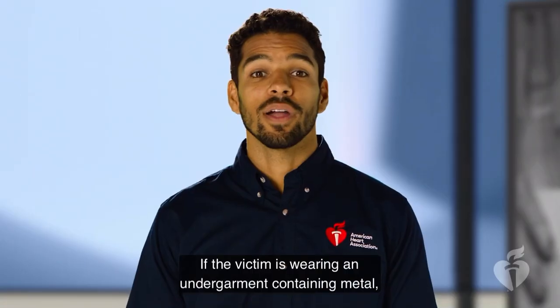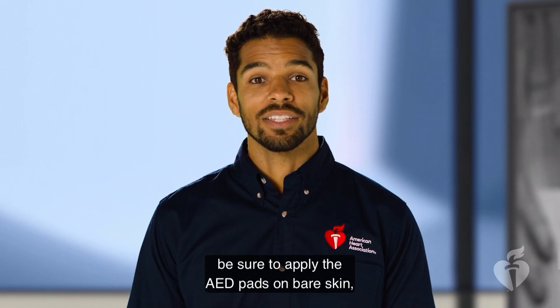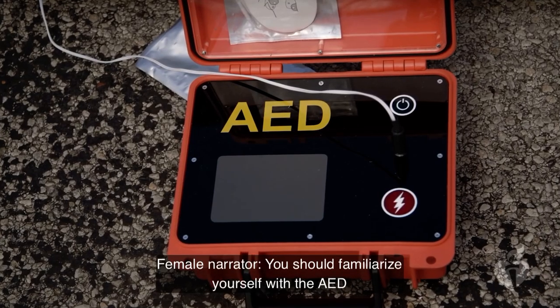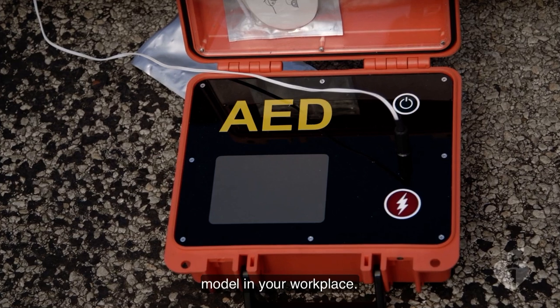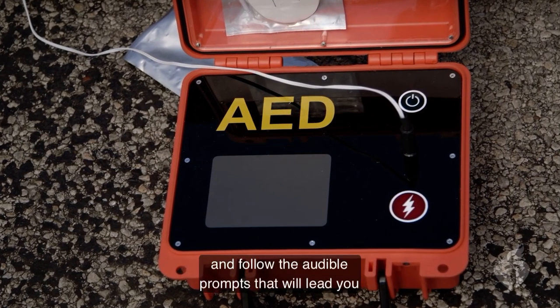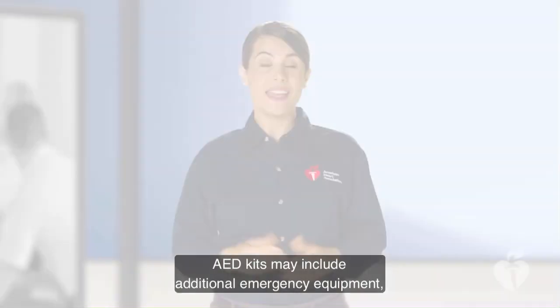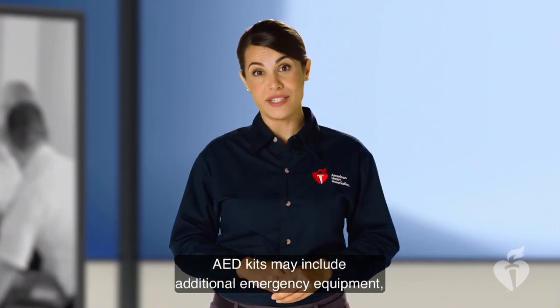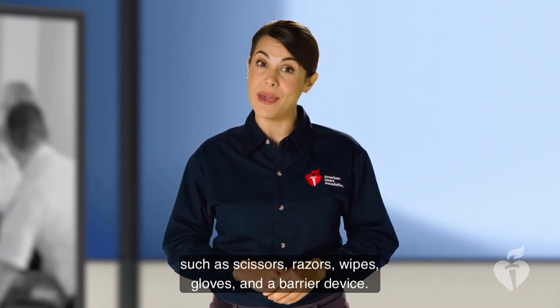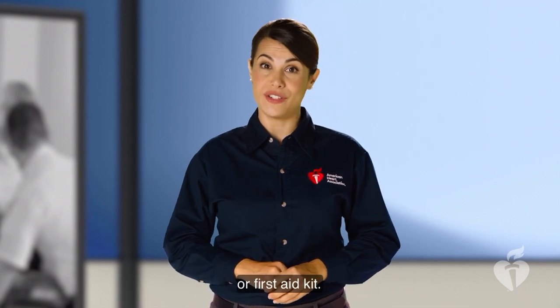If the victim is wearing an undergarment containing metal, be sure to apply the AED pads on bare skin, avoiding contact with the garment. You should familiarize yourself with the AED model in your workplace. Regardless of the type of AED, remember to turn it on first and follow the audible prompts that will lead you through the rest of the steps. AED kits may include additional emergency equipment, such as scissors, razors, wipes, gloves, and a barrier device. These items may also be found in a separate emergency or first aid kit.